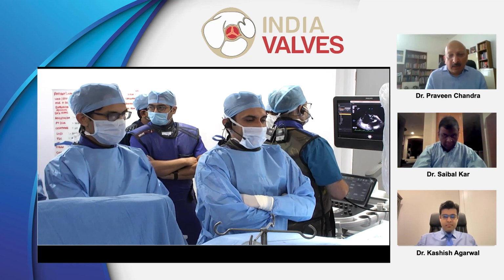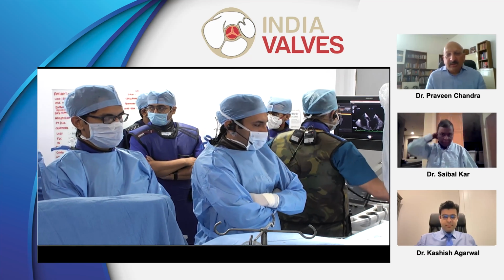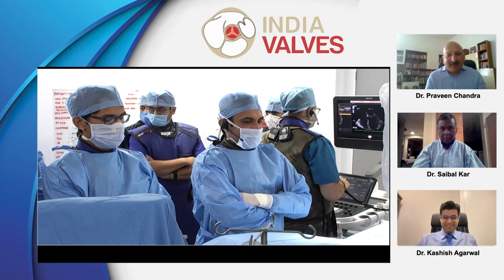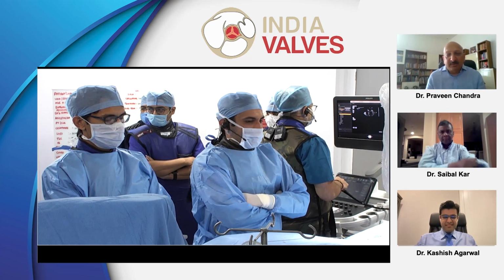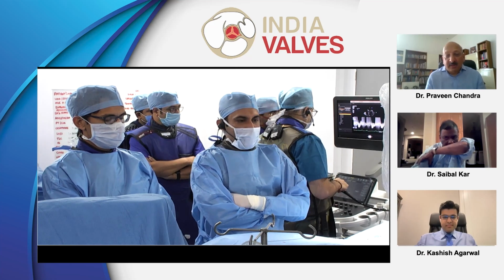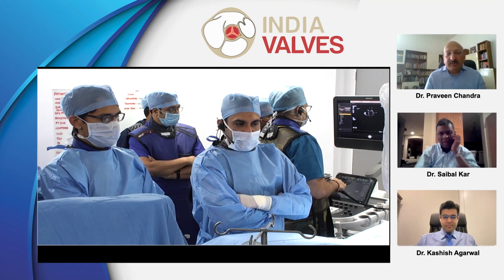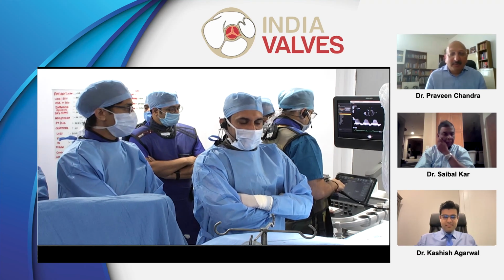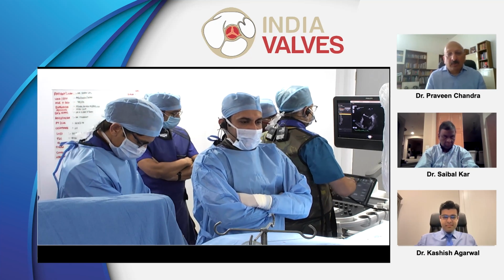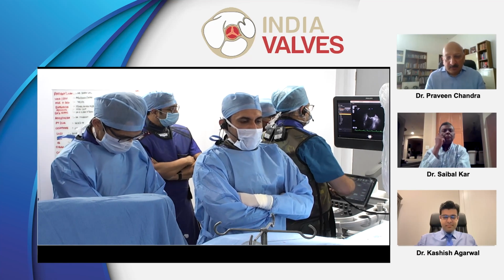And we have now on the panel Dr. Kashish, who is again a very serious operator on TAVI and MitraClips, and he has done thousands now. He is now going to present the 5,000 patient study at ESC in 2 days' time, and I don't know whether he will share with us the data or not. But we are very much interested to have him here because he has so much experience. So we will have to learn from him a lot in terms of this MitraClip step by step.